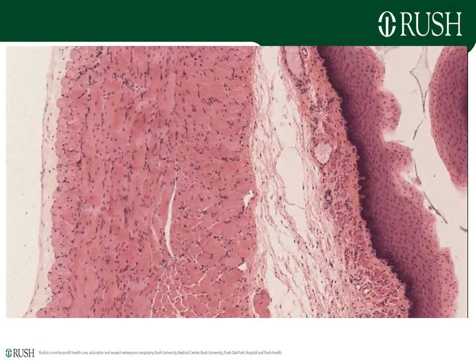Here is an image of the wall of the esophagus. You can see on the right side here is the stratified squamous non-keratinized epithelia, and then there is the submucosal layer under that, and the very thick muscularis externa here, and a serosa on the outside.